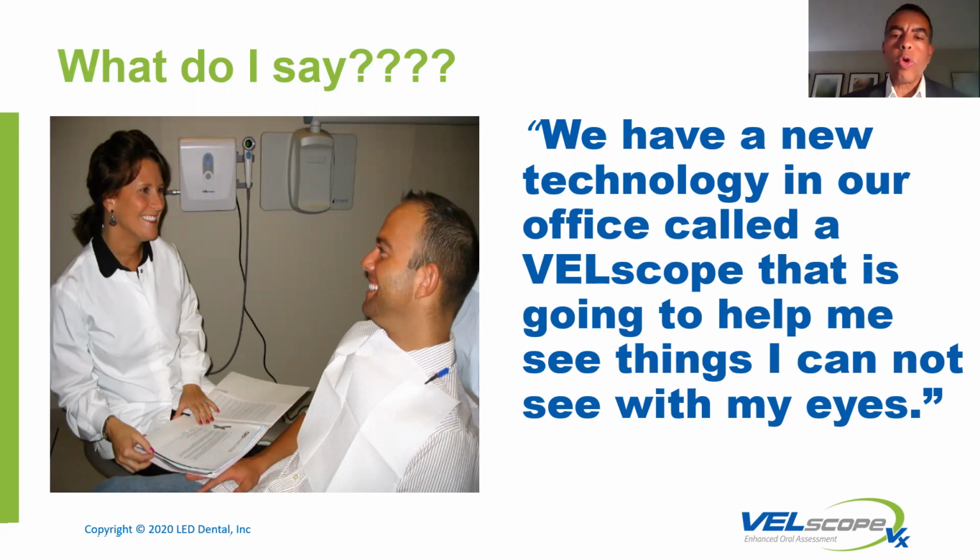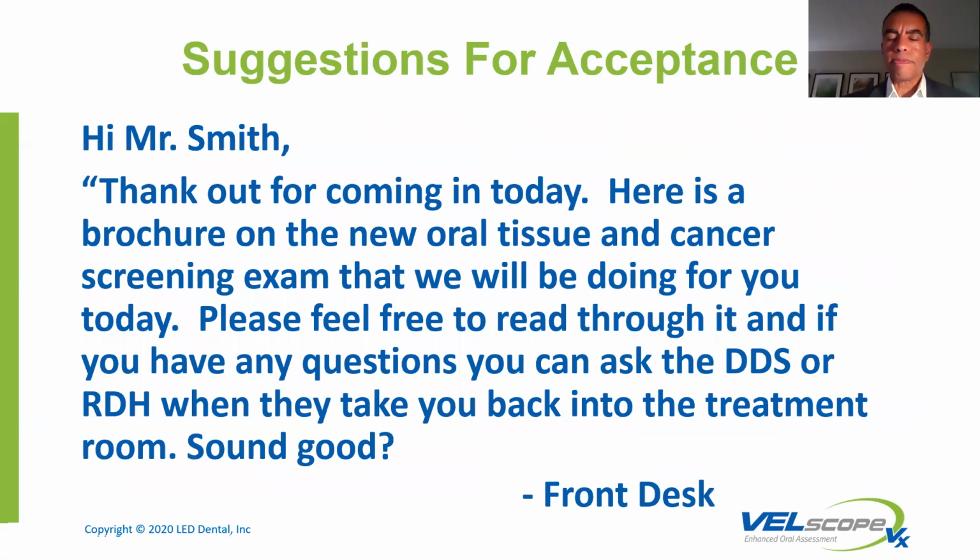And so I stole, and I'm saying that proudly, I stole from a practice that had 90+% acceptance, their technique, which was very methodical in their approach to understanding what was working, what wasn't, verbiage, when, where. And what they came up with was, I thought, quite creative. And it started with the front desk. So patient comes in, normally they're signing their name in or checking in. The front desk person says, hey, thanks for coming in, Mr. Smith, and gives them information, whether it's a VELscope brochure or a lamination that describes what the VELscope is, or just some basic information that some offices have made up for themselves.